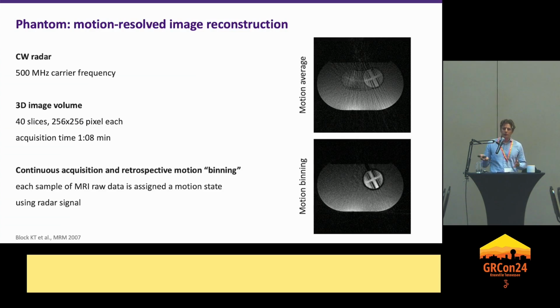And if you compare the top and the bottom picture, you can appreciate that this technique helps to get rid of the motion artifacts in the image.